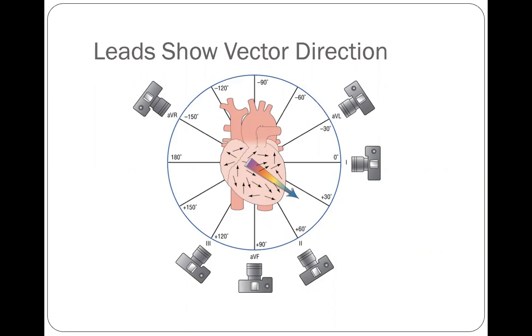And then just remember that each of the cameras are split equidistant from each other. We have 4 leads that produce 6 views of the heart, as we've discussed in the past, which means that we have 6 lines cutting this circle, which creates 12 pieces of pie. And 12 goes into 360 30 times. So 30-degree increments is what we're talking about in terms of each of the degrees of these cameras.